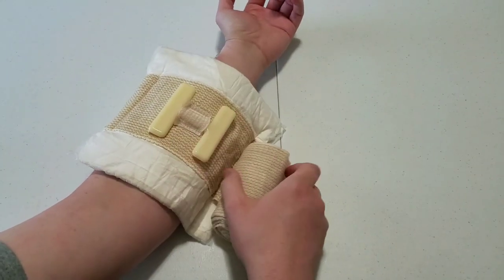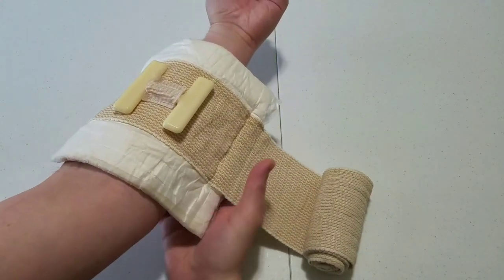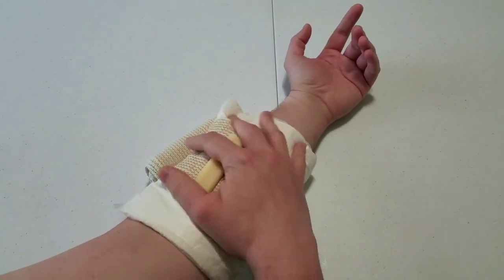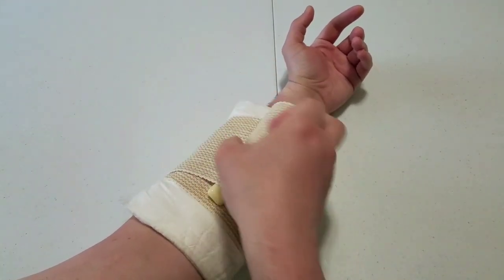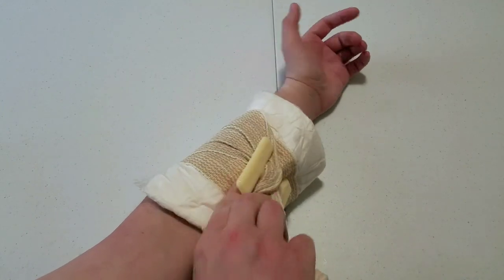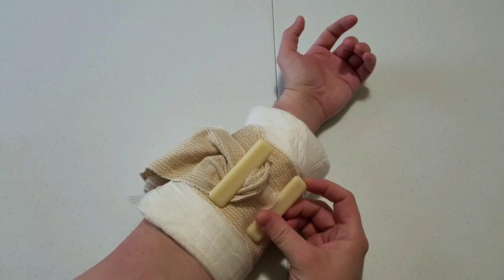We're going to put it over where I said I was injured. To get it started you kind of have to work it around, get that piece of Velcro there. It wants to slide around a lot at first until you get it tight. You're going to come around and go through one side of that H, just like that, then go under the other side — so you're making a U around one side of that letter H.